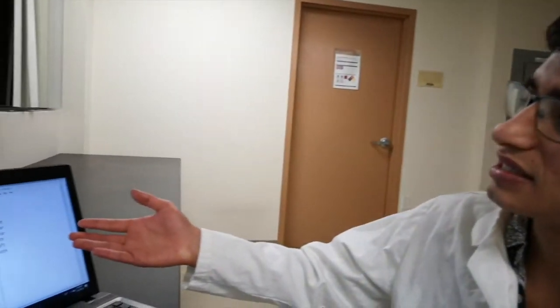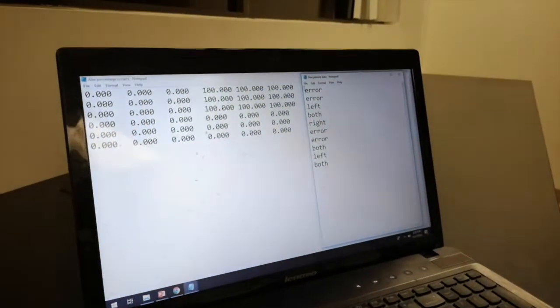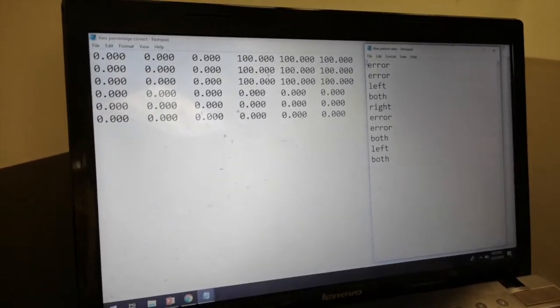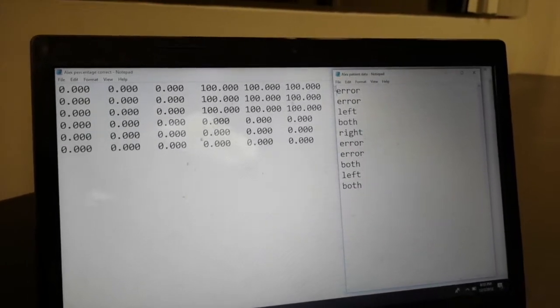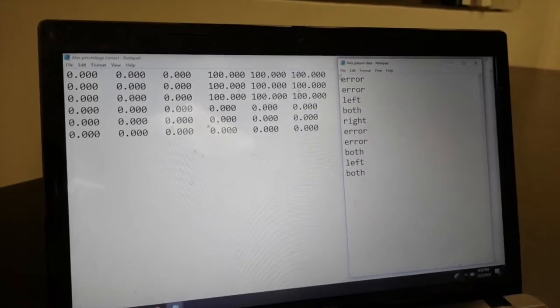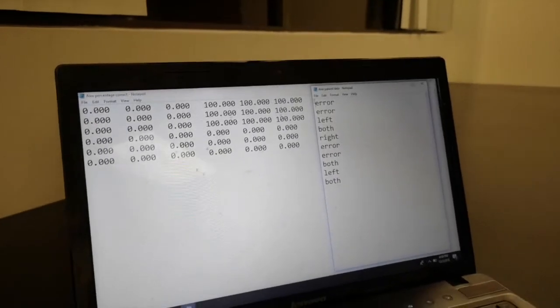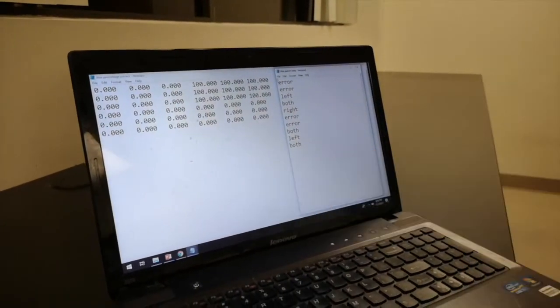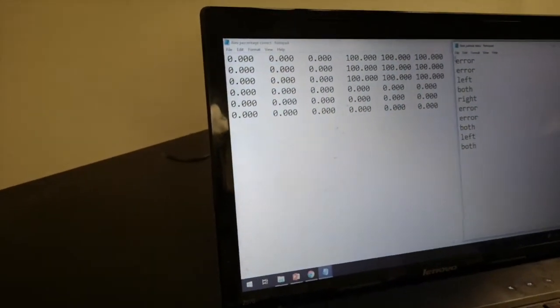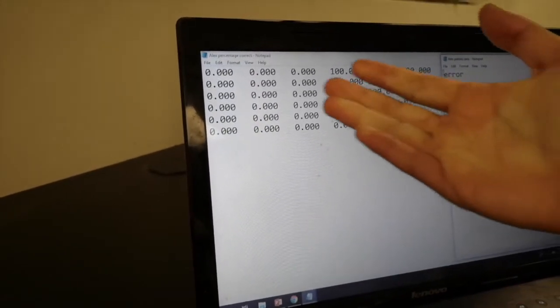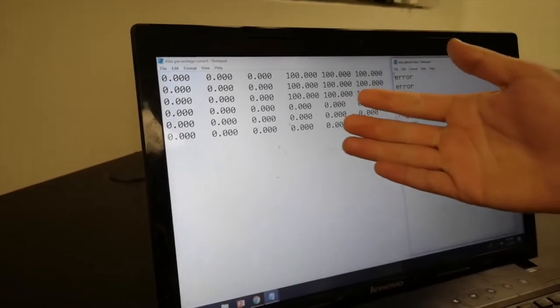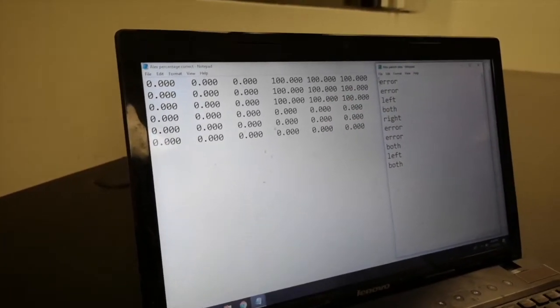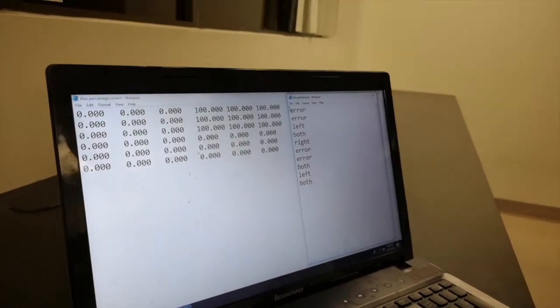Let's take a look at Alex's results. For some of these, he said left, right, or both, which means he saw either an emoji on the left side, an emoji on the right side, or emojis on both sides. Some of these say error, which either means that he cheated or that he didn't see anything and it timed out. On this side, we see the percentages for each location in his visual field. On the left side, there are a lot of zeros, and on the right side, he got a lot of hundreds. That indicates that he probably has visual neglect on his left side.